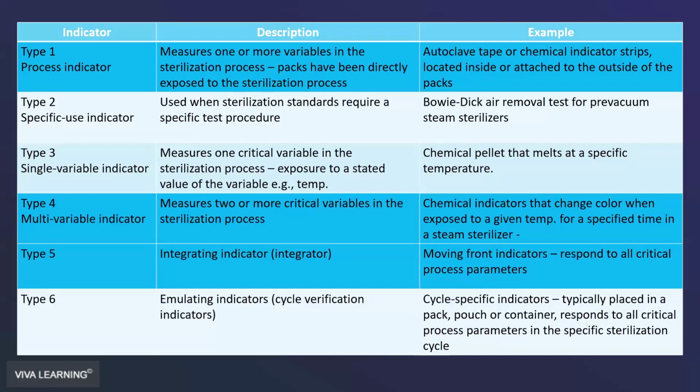Question, should we be using instant sterilization? I think you mean immediate use sterilization for Cavitron tips inside cassettes. Follow the manufacturer's instructions for the ultrasonic inserts. I would certainly put an ultrasonic insert inside of a cassette.